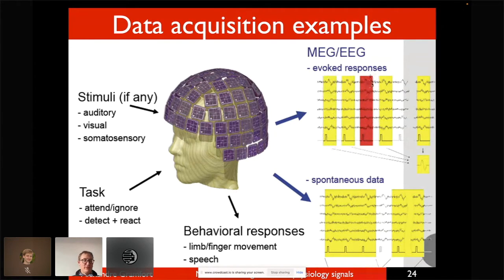An important piece of information is that I would say almost all the artifacts that you find in EEG and MEG are amplitude artifacts. Okay, so what matters in order to remove these artifacts is to identify where you have huge amplitude artifacts or huge variance that you collect, and this is a source. This is basically the signature of artifacts.